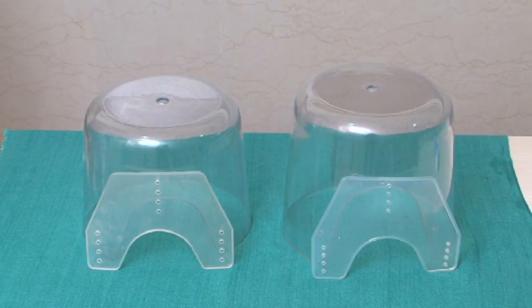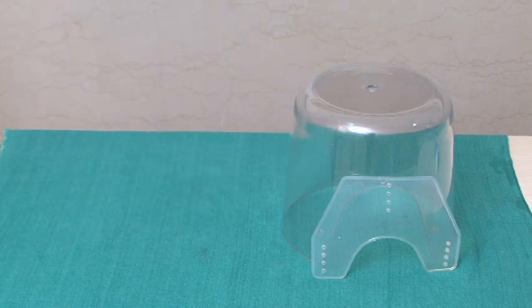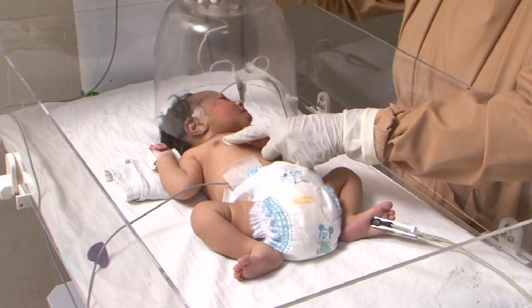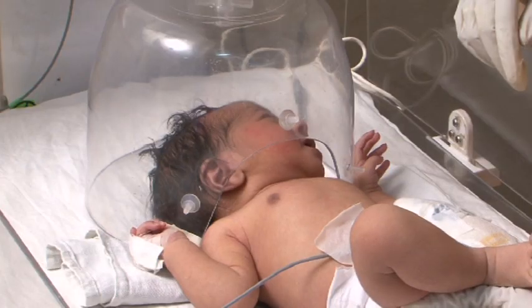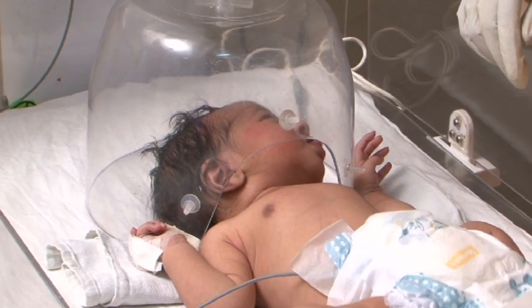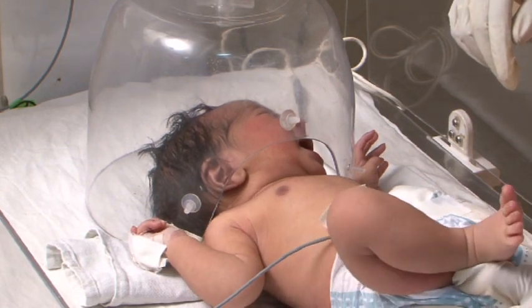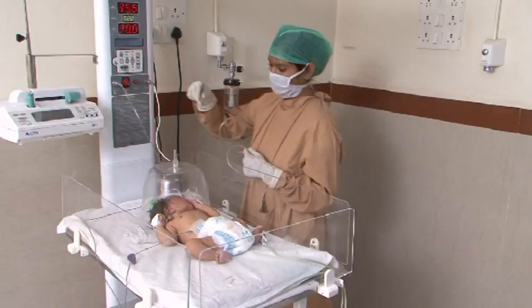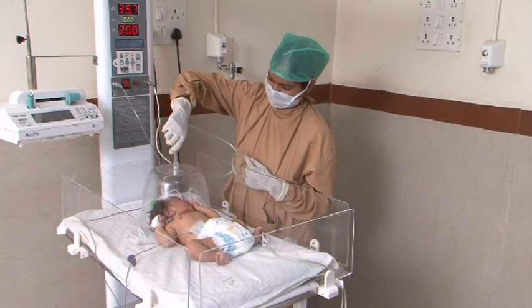Select the right size of the head box for newborn or infant. Place a head box over the baby's head. Ensure that the baby's head stays within the head box even when the baby moves. Connect through tubing to the oxygen source.